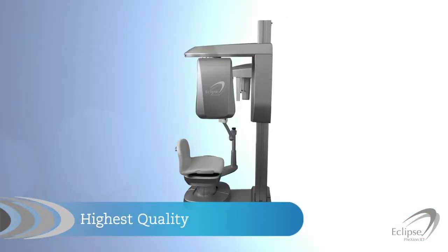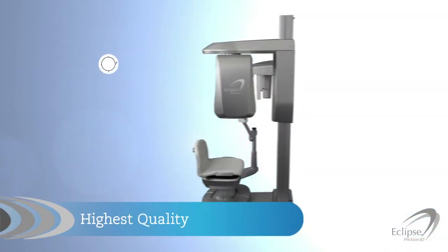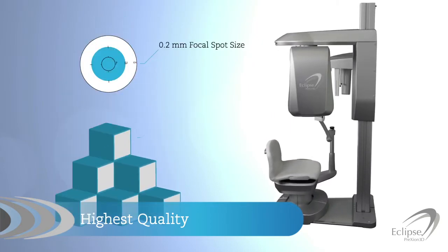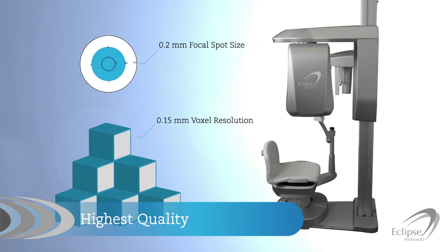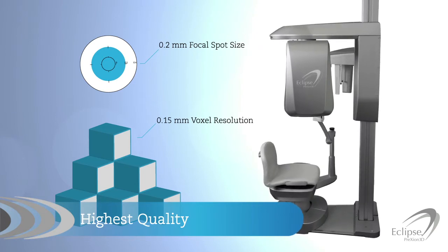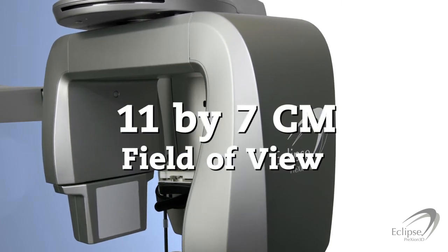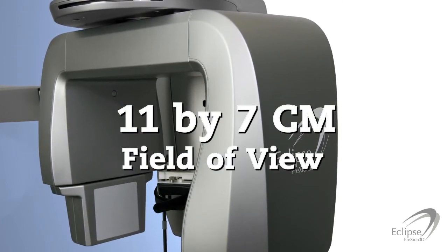Unlike other 3D scanners, the Eclipse uses a 0.2 mm focal point size and 0.15 mm voxel resolution, resulting in the highest quality captured data. It offers 8x8 cm and an 11x7 cm fields of view and 3 flexible modes.